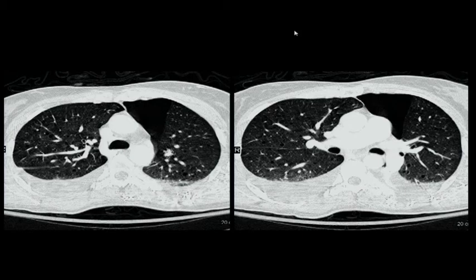So patient presented with acute chest pain. Is it like pneumothorax? It was a pneumothorax, okay. Filling defect where? It's just a vessel. It's just a different part, sorry. So you have identified a pneumothorax. Have you identified anything else? You said pleural effusion bilateral? Right on the first image, left on the second image? Bilateral, right greater than left. Okay. Anything else that looks abnormal?